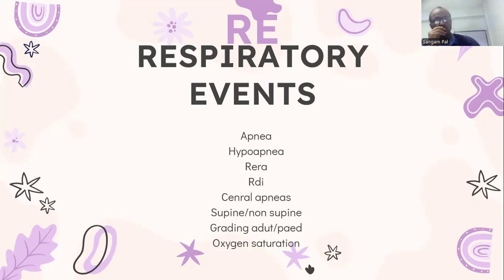So the grading of apnea and hypopnea in adults is like, when there is 5 to 15, it's called mild. 15 to 30, it's moderate. And more than 30 is severe apnea hypopnea. And less than 5 is normal. And in children, less than 1 is normal. 1 to 5 is mild apnea hypopnea. And 5 to 10 is moderate. And more than 10 is a severe degree of obstructive sleep apnea.